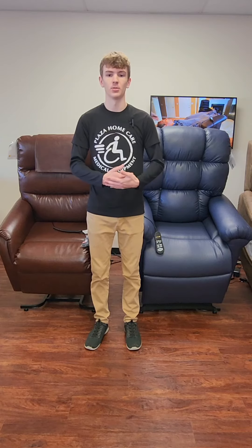It's very important to know which chair fits you best, so you're comfortable and you don't strain getting in and out of it. A good tip is being able to have your feet flat on the floor while you're in a sitting position.